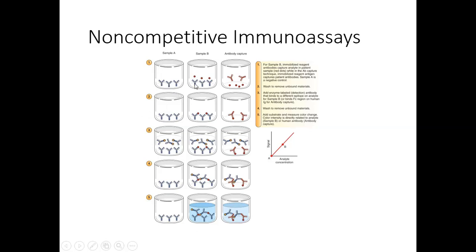In both cases, you can see we have immobilized antibody here on a solid surface. We add the sample to the test. Remember, this is non-competitive, so I'm only adding the patient sample, or the control sample. If the antigen is present, it binds to the antibody. We let it sit for the amount of time the manufacturer tells us to wait. They'll say, let it incubate for 10 minutes, or let it incubate for 2 hours. It will tell you how long to incubate. You let it incubate and either form or not form immune complexes.